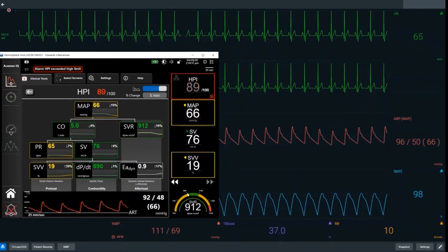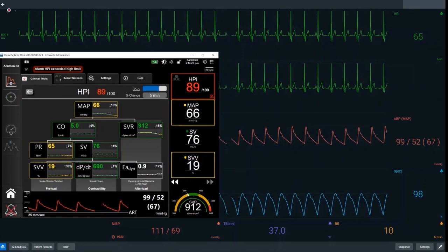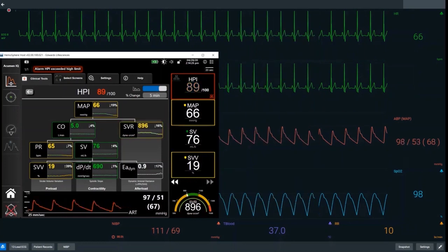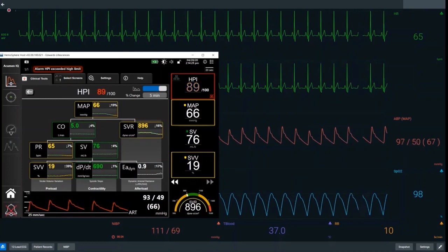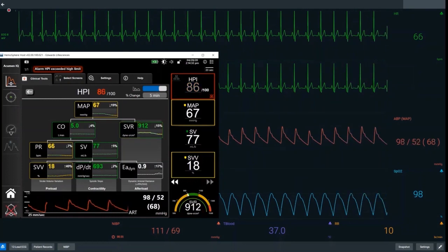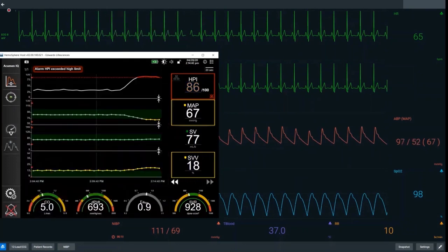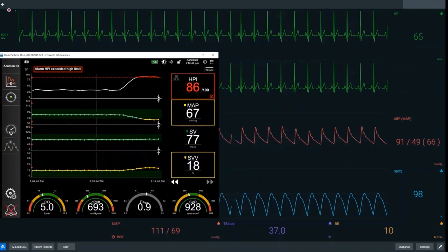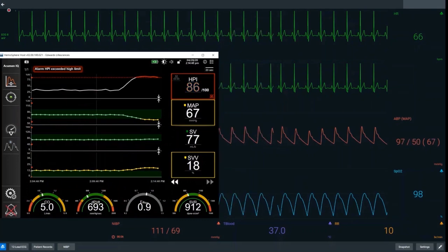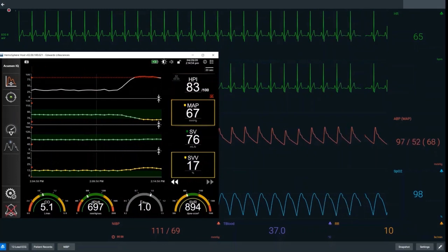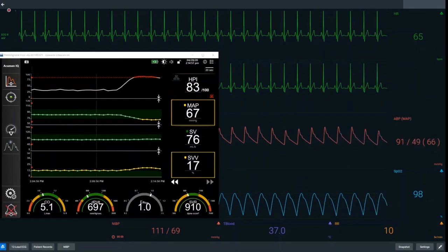It's also important to note that dP/dT, the surrogate for contractility, has not changed over the last five minutes. The deranged physiology we're seeing is a raised SVV; however, because EADYN is low, giving fluid will increase flow but will not increase blood pressure. We can see that SVR is also starting to decrease, currently down by 15% over the last five minutes.